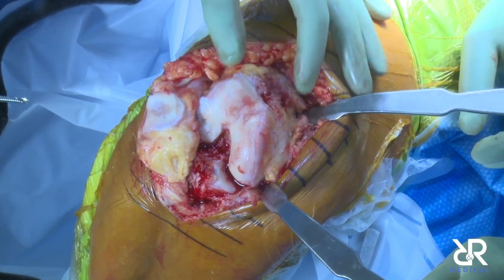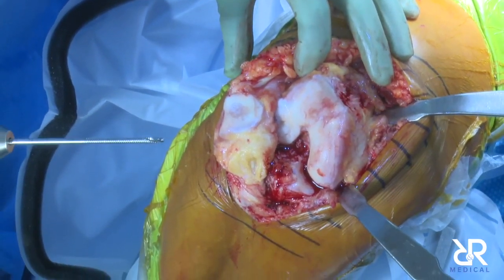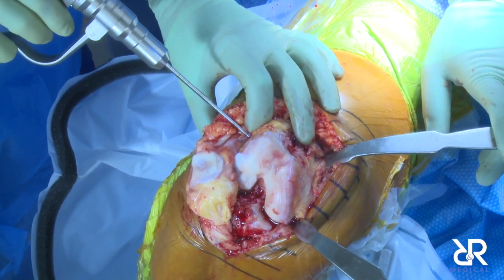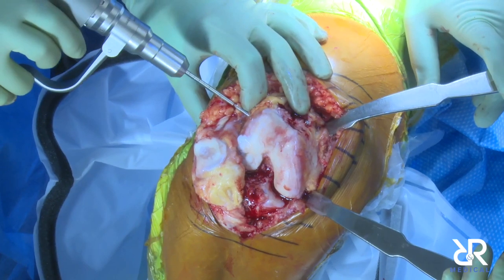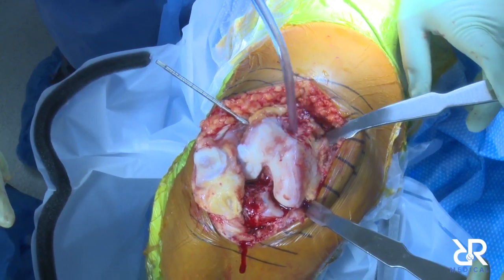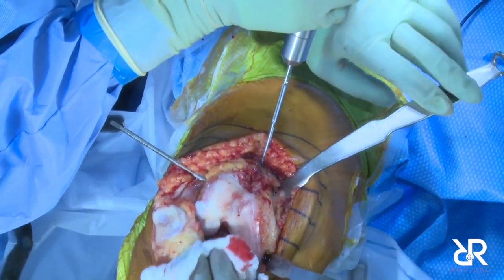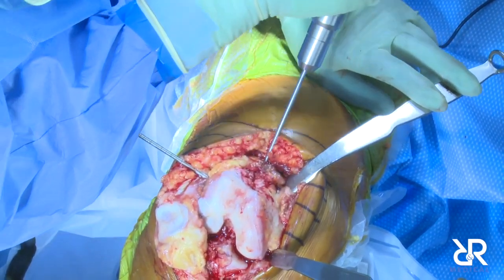So, you saw the exposure. I mean, you didn't see the exposure, but you know how to expose a knee, so this isn't rocket science. We put two pins in, one in the femur. So back out a little bit with the camera. Sort of right above the quad tendon. The slider. The critical part about the slider is to have it far away enough so it doesn't interfere with the robot. And so I put it fairly up high on the femur here. And I get it started. And then I drop it down.